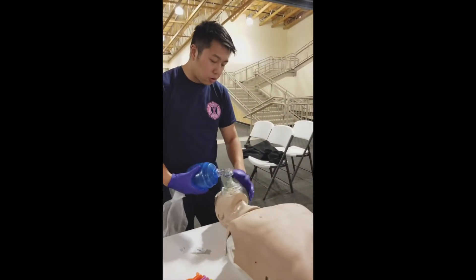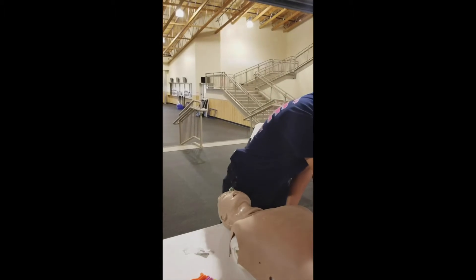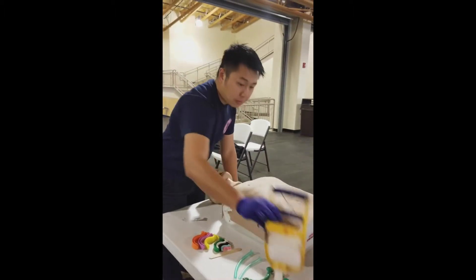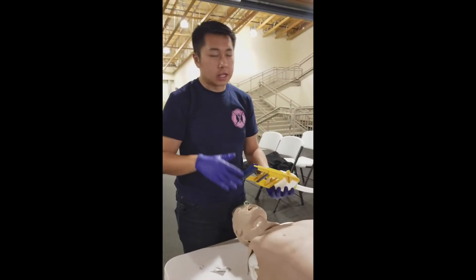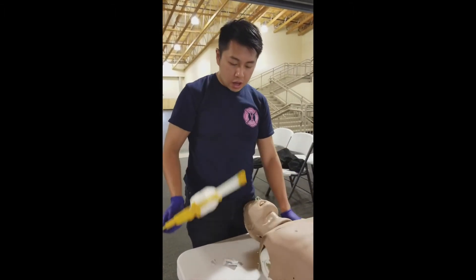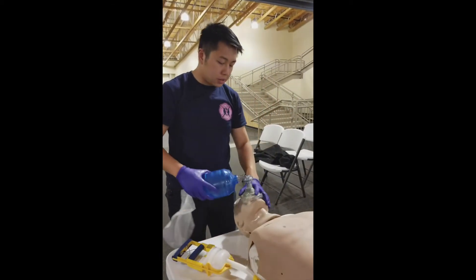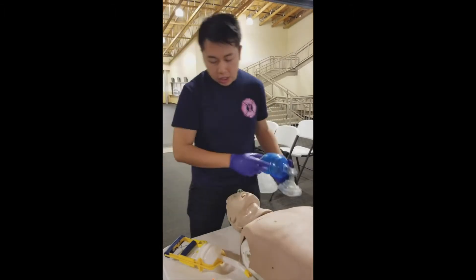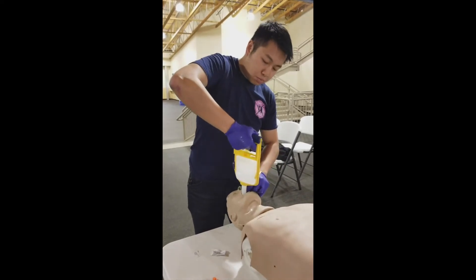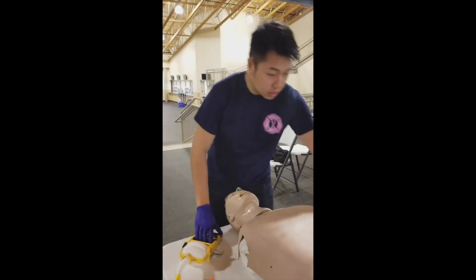You should see your chest rise and fall as before — head tilt chin lift — and secure your BVM, making sure it has a proper seal. The last thing we're going to go over is suctioning a patient. This is if you have a patient that's vomiting, has blood in the airway, or other secretions. Take the cap off, then pre-oxygenate your patient — deliver one or two quick breaths. After pre-oxygenation, insert the suction only as far as you can see, then pull up and start suctioning out as much as you can. Take it out and you can resume ventilations.